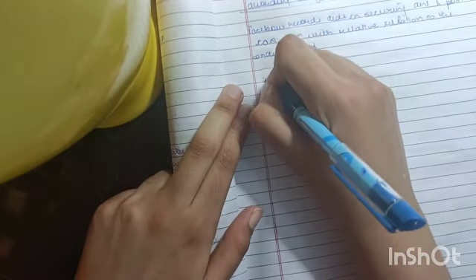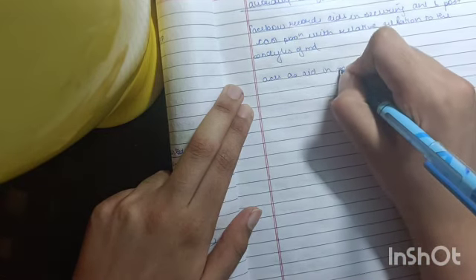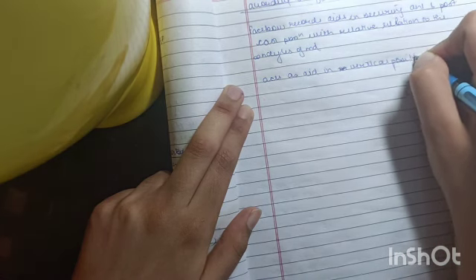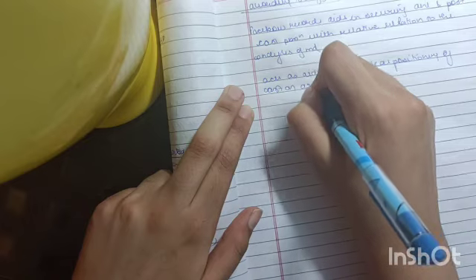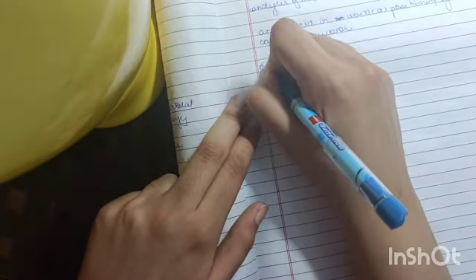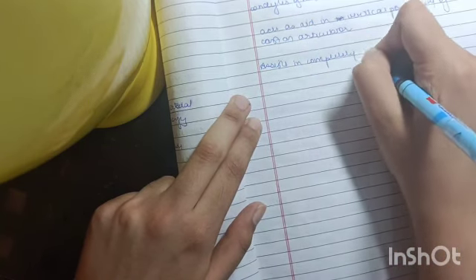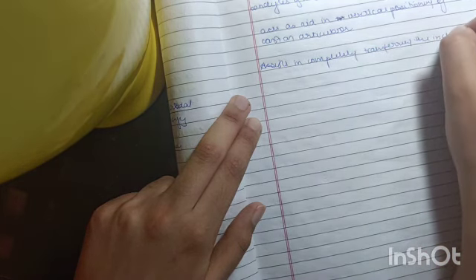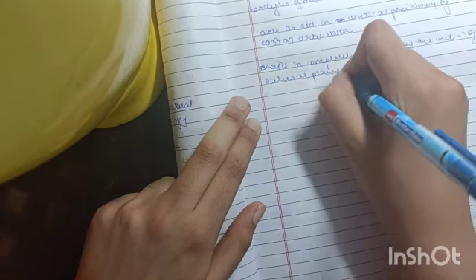Then it also acts as an aid in vertical positioning of cast on articulator. Then it assists in completely transferring the inclination of occlusal plane to articulator.